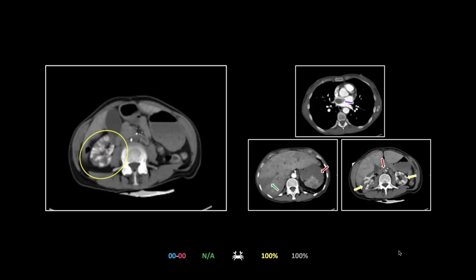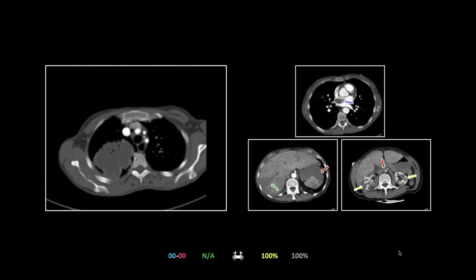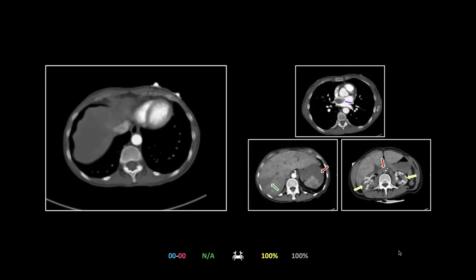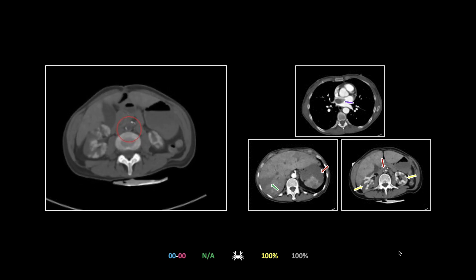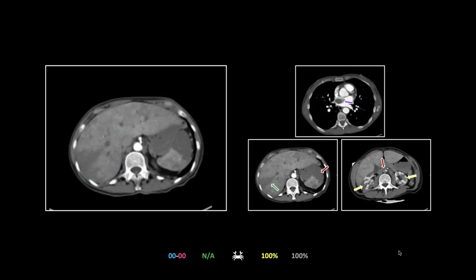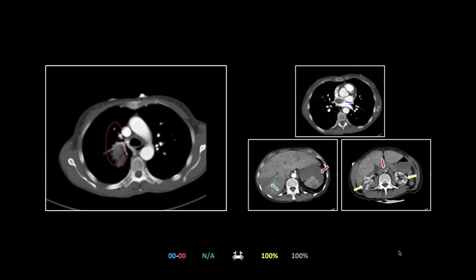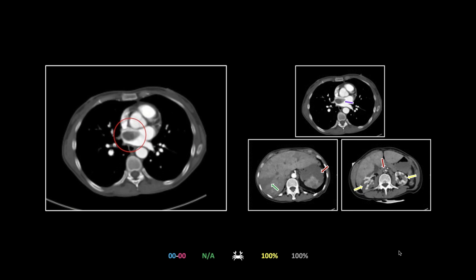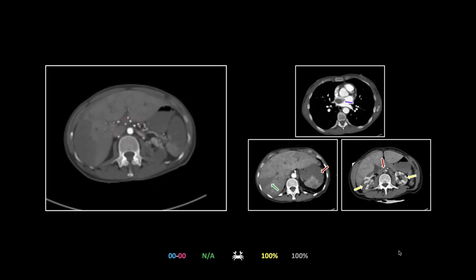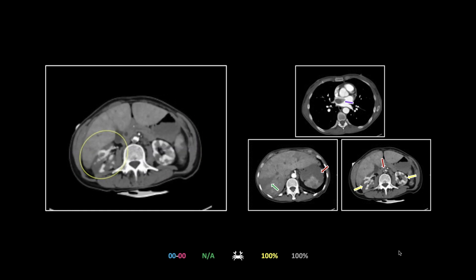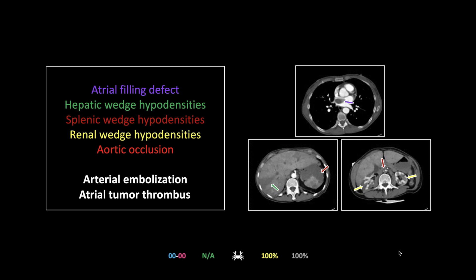The aorta is also occluded low down. Liver infarct, splenic infarct, renal infarcts — classic wedge-shaped cortical distribution. And look at where it all came from: a huge mass in the right upper lobe invading the pulmonary vein and gaining access to the right atrium. This is a primary lung cancer with pulmonary venous and atrial invasion and extensive arterial embolization. Another one I don't think AI is going to be figuring out anytime soon.